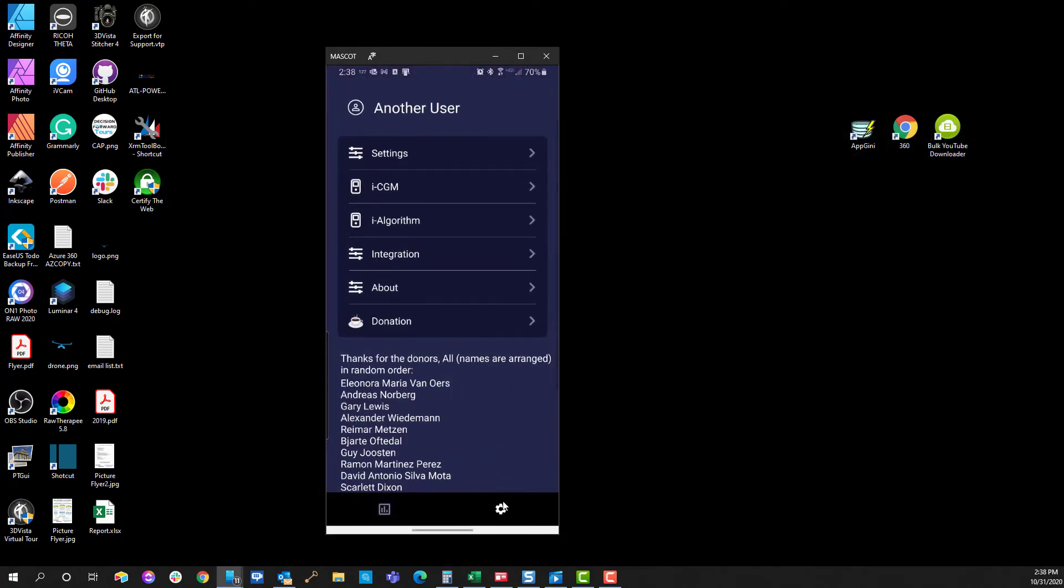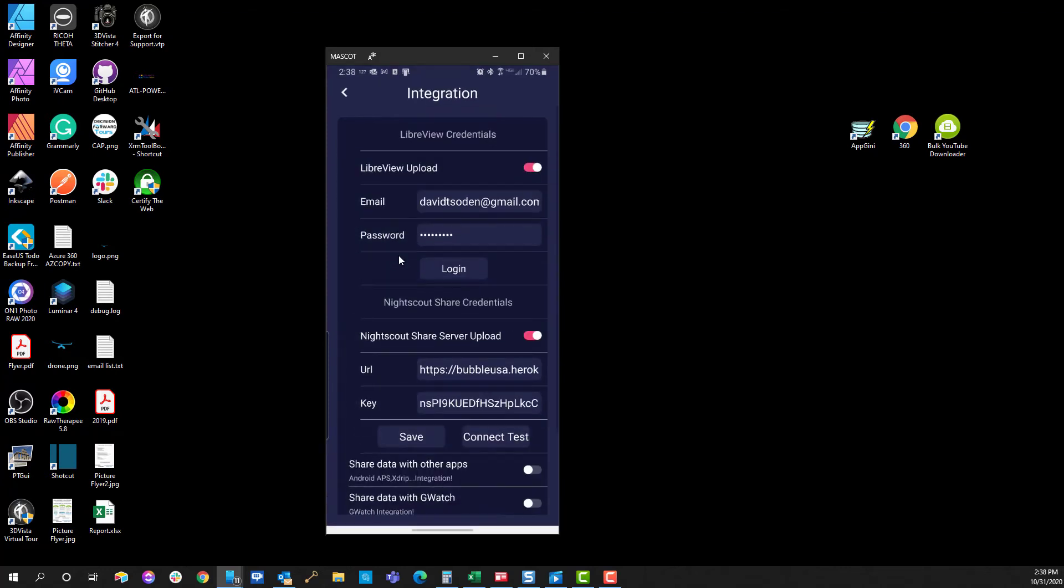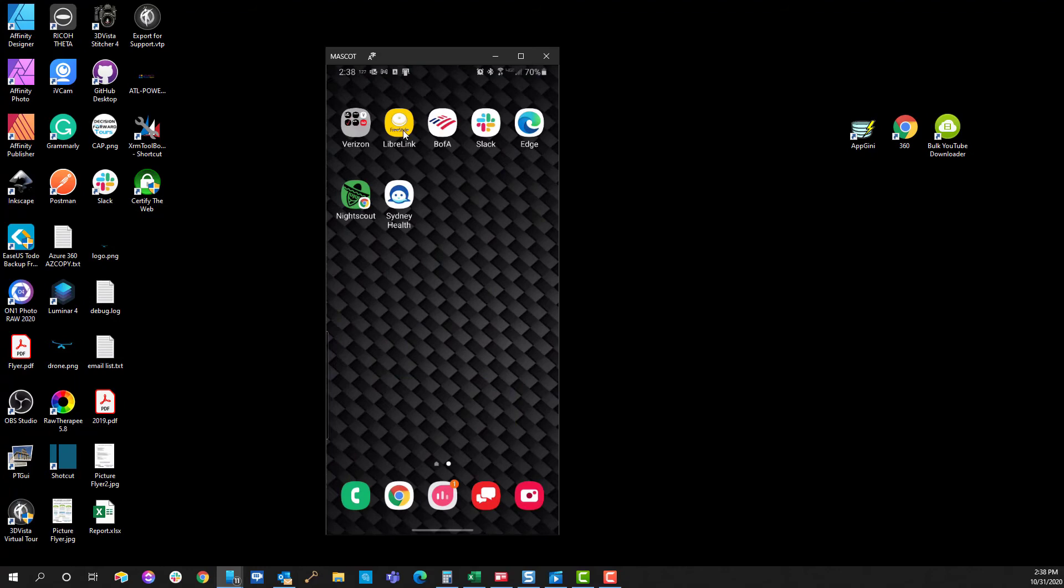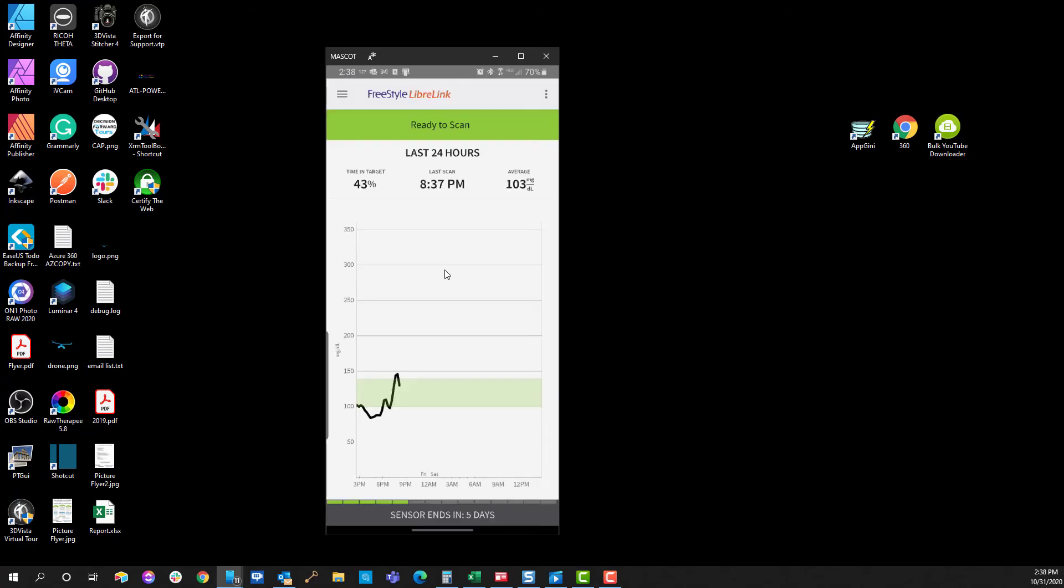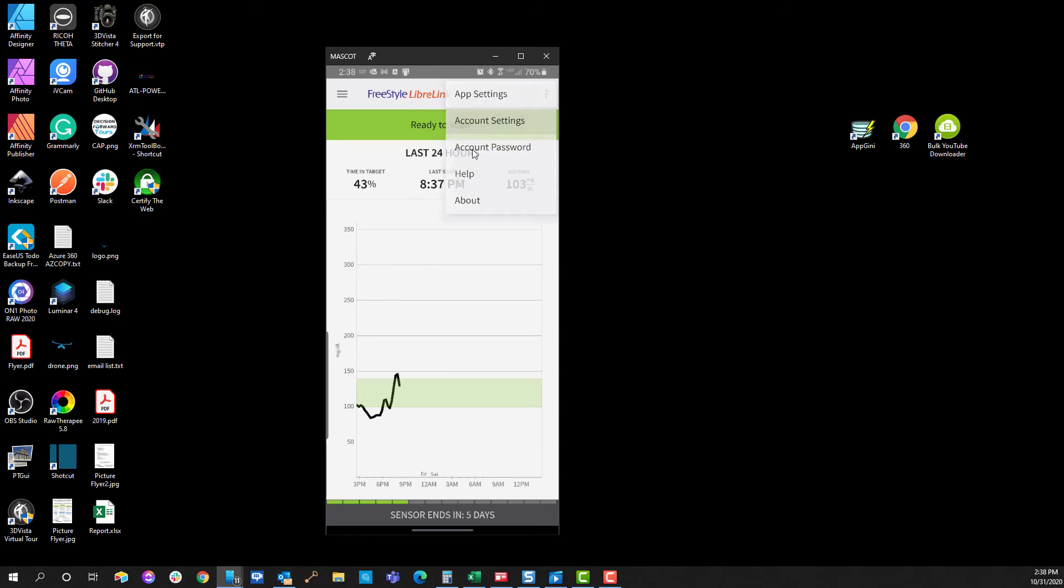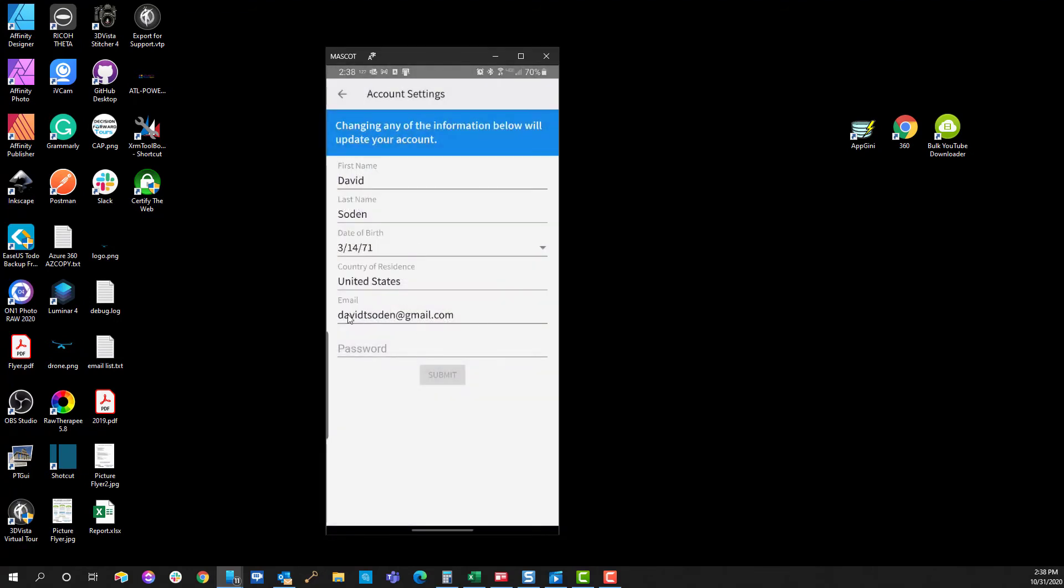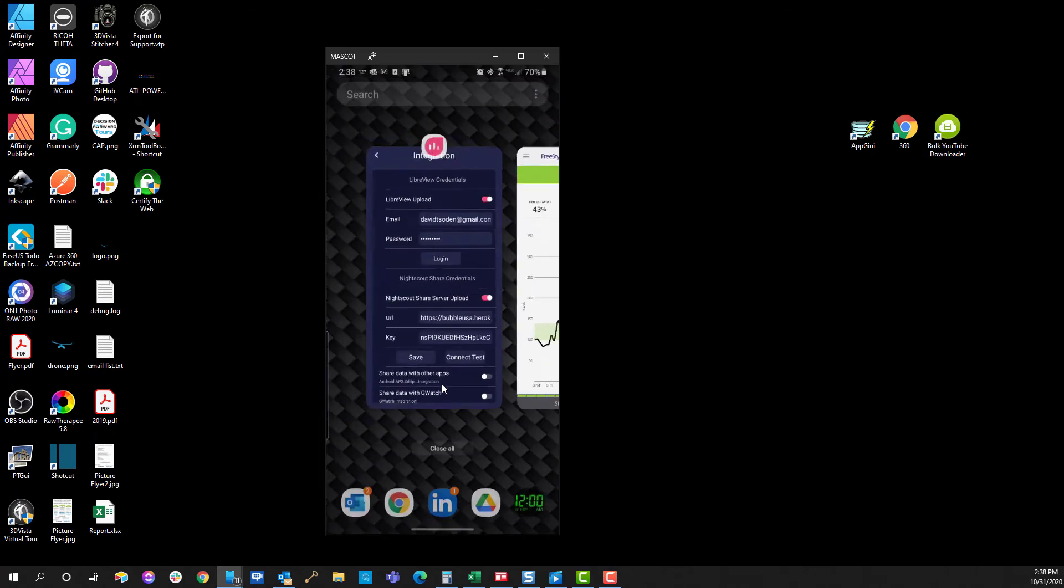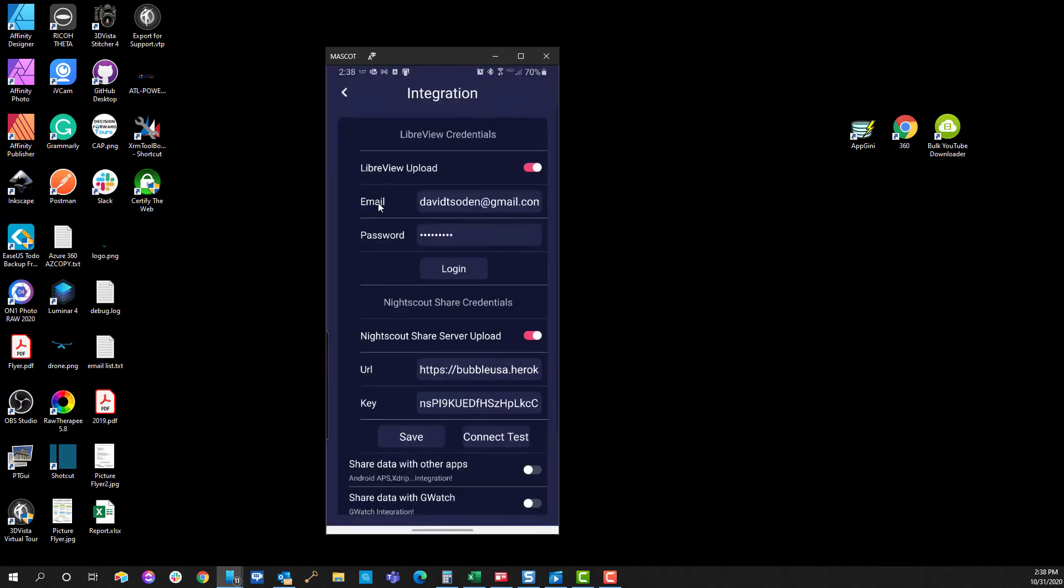Some other things that may be of interest—this is in the settings area under the integration—I have two integrations set up. This is the LibreView upload and this is Nightscout. I'm going to show you each one of these. When you set up your Libre software, this is Libre Link. This is a native piece of software that comes with your Freestyle Libre. In order to use this, you have to create an account or account settings. That account is my email, the one that I had set up is davidtsoden@gmail.com.